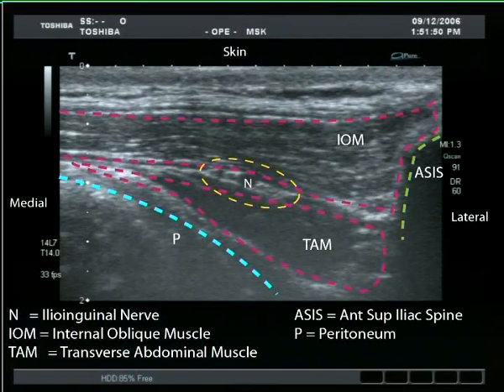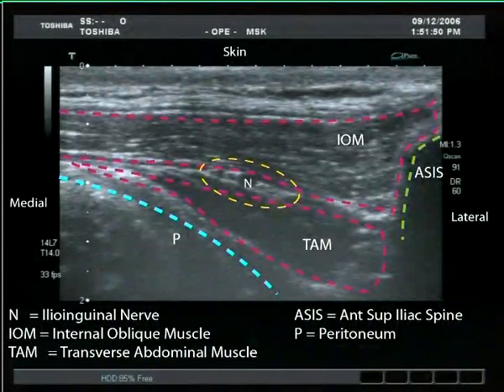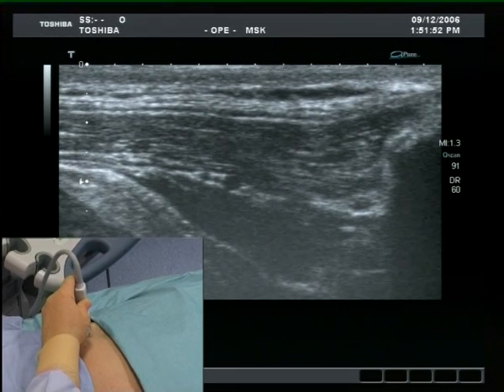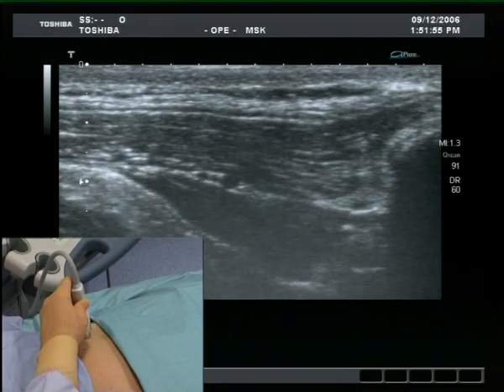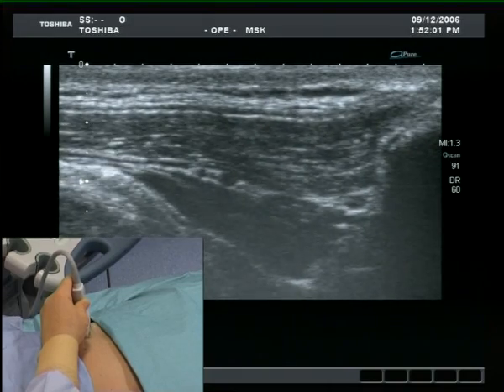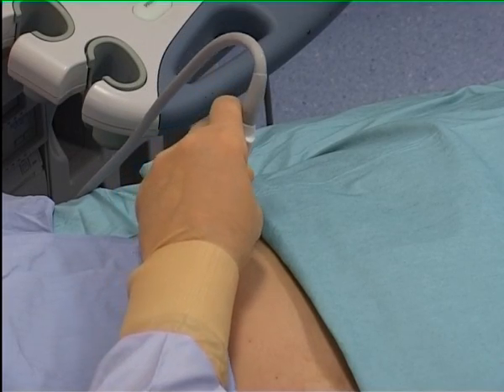In 50% of cases, only two muscle layers can be identified at this level. The internal oblique muscle is clearly seen separate and superior to the transversus abdominis muscle. The nerves lie between these two muscle layers.